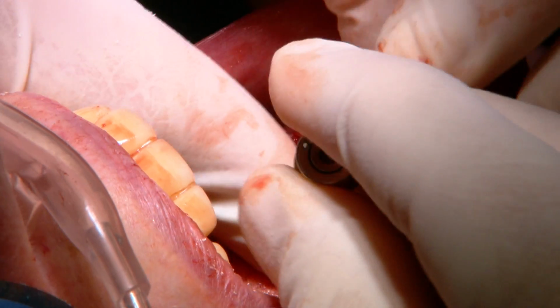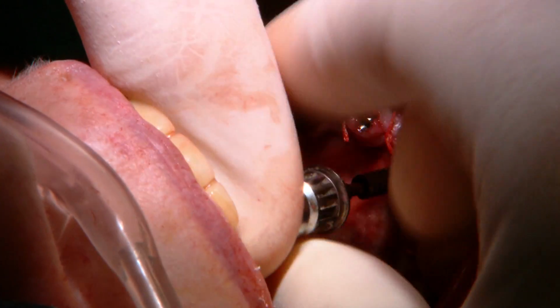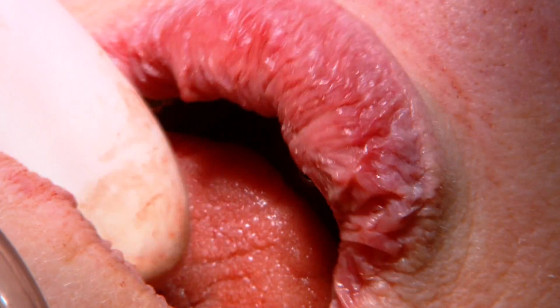At this stage, with the surgery finished, we allow the sedation to wear off so that she can give us maximum cooperation to fit the new teeth. So what we're doing now is attaching cylinders to our abutments, and these will be the way that the bridge gets attached to the connectors. Cylinders are in. Now we get our surgical guide.